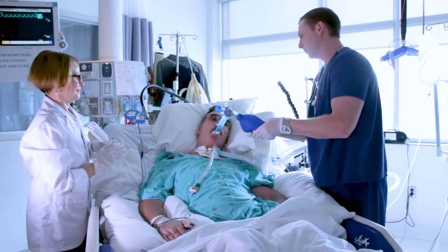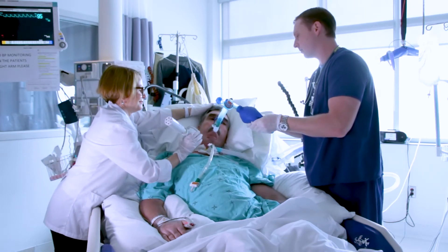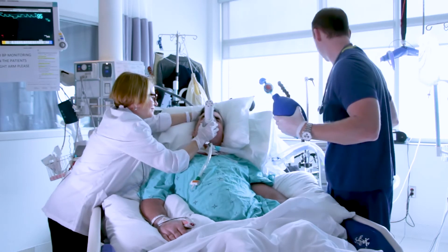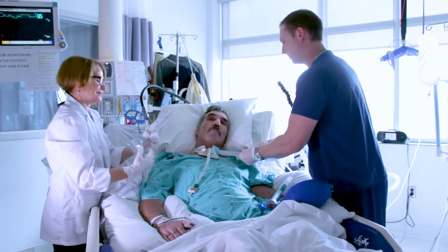Okay. One, two, three, four, five, six — and I'll connect you back to the ventilator.